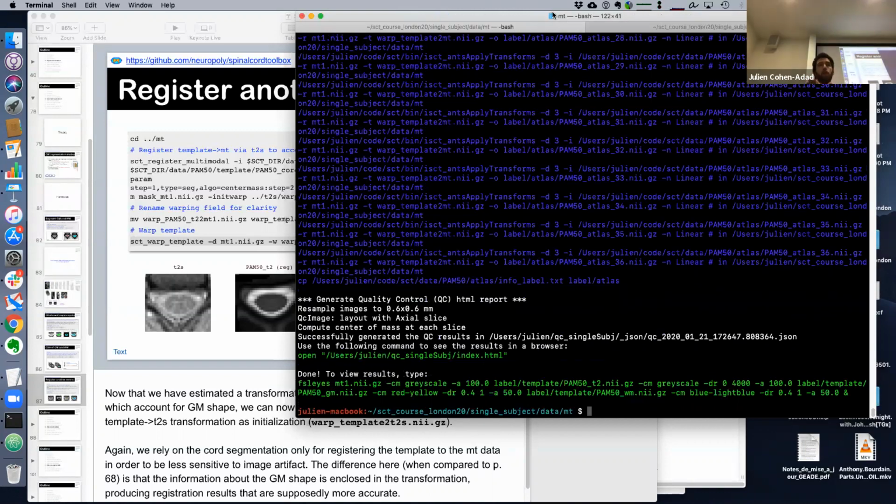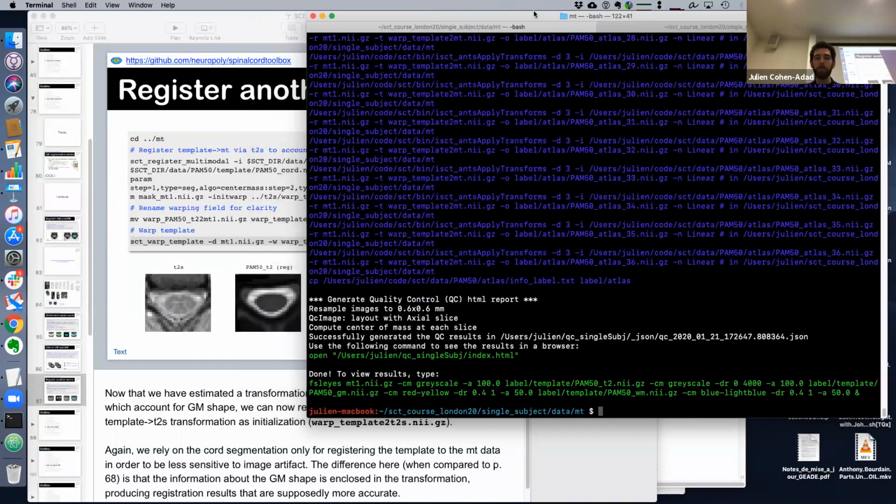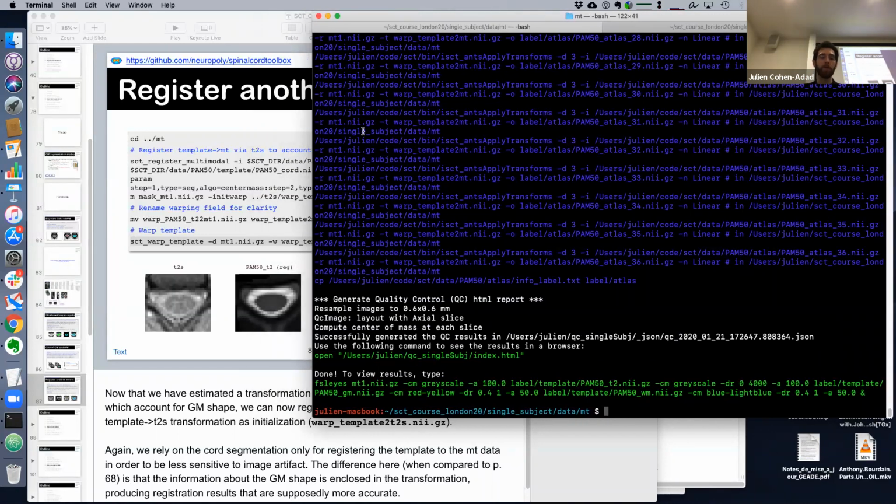It does exist, but in most of the cases, it's submillimetric. So even if you're dealing with metrics with a coarse resolution, and if you're integrating the metrics across different slices and tracts, that lack of gray matter shape information will not affect your metric extraction very much. That's the message.